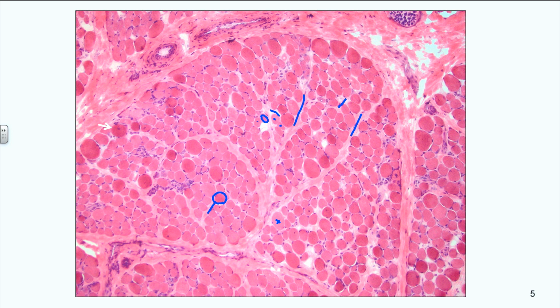Hyalinized fibers or hypercontracted fibers are fibers in which, because of an abnormality of the membrane, the circulation of ions, particularly calcium, in and outside of the fiber is disturbed. So these fibers have a lot of calcium in them and they are hypercontracted, as if they are in a constant state of cramp. These are the fibers that we would see in subsets of, most likely, many of the muscular dystrophy cases. Somehow they are a sign in a muscle biopsy that we may be dealing with a muscular dystrophy.